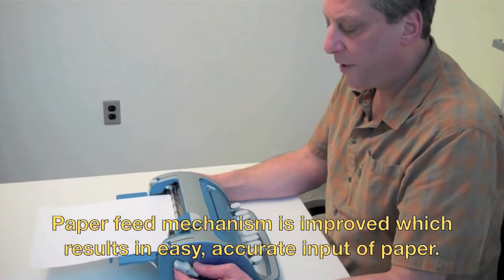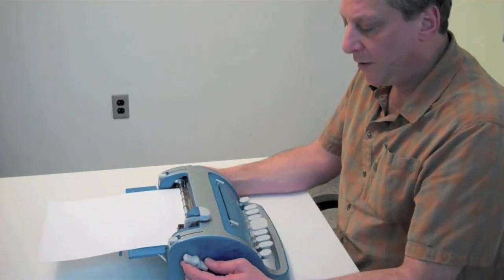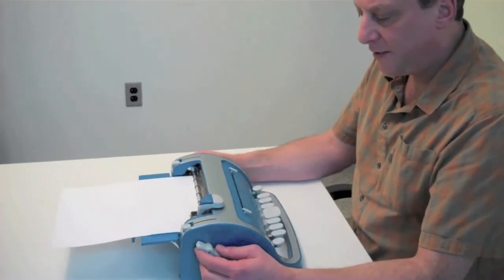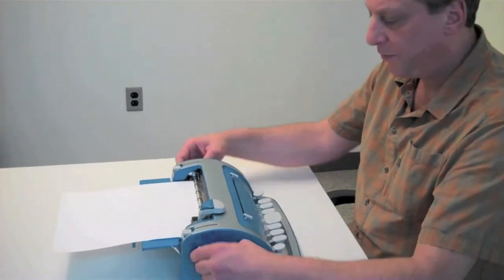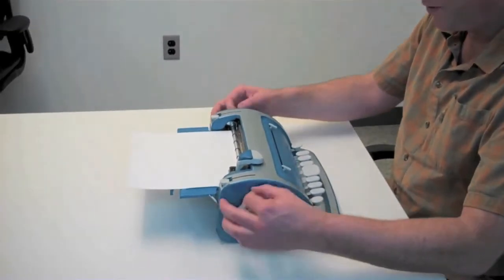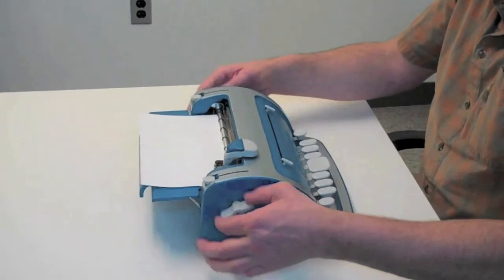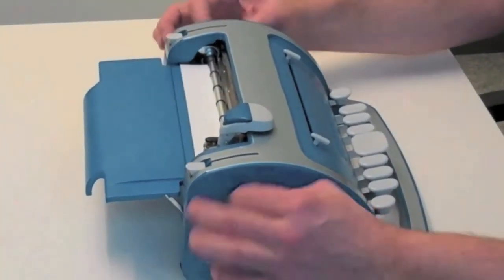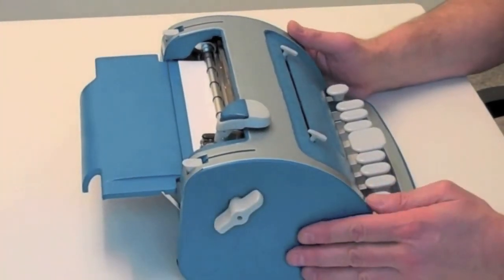Okay, now I'd like to speak about the paper grip mechanism. The drum has been redesigned to grip more of the paper. So therefore the paper will go into the machine and be held into the machine much tighter.